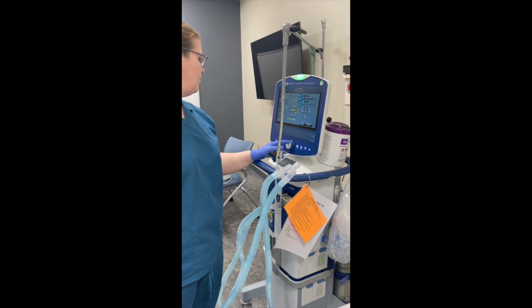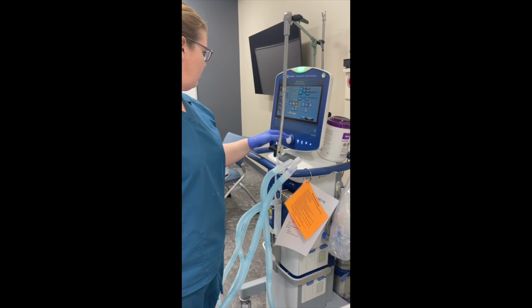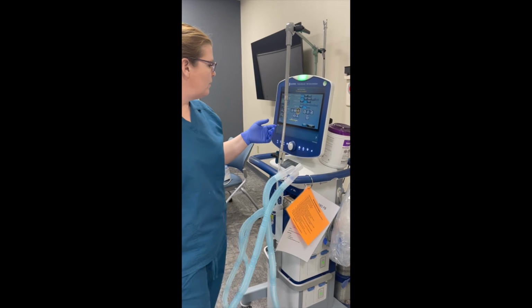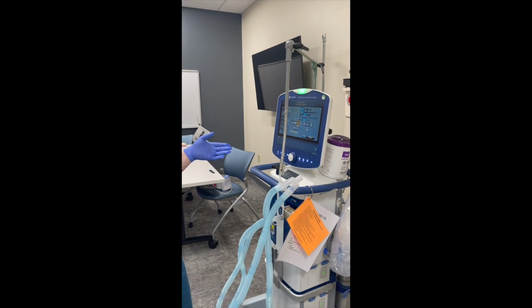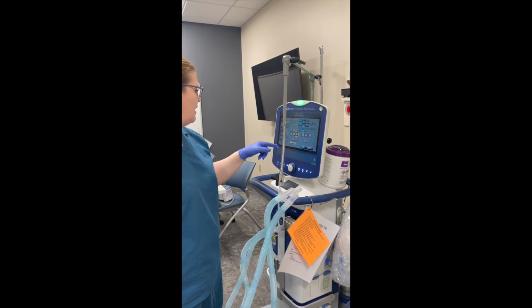So we've got 0.9 second I time and a 1 to 3.7 ratio for I time to E time. And then our flow is set at 60.